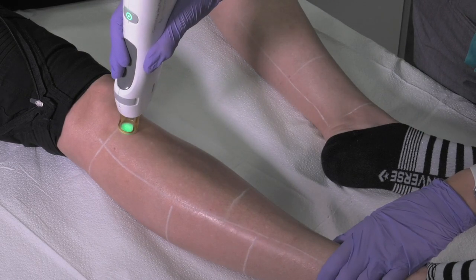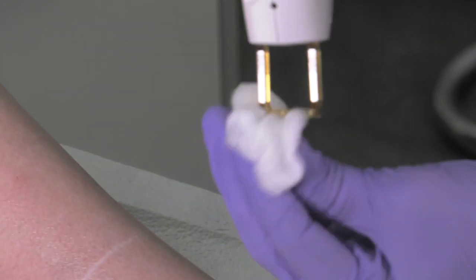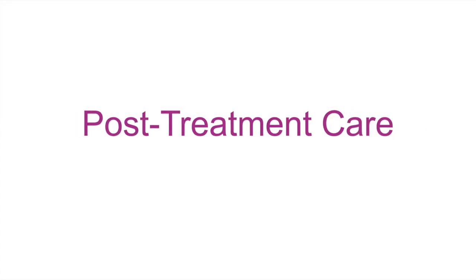Every 50 pulses, the distance gauge should be wiped clean to prevent debris buildup. This can be done with moistened white gauze.